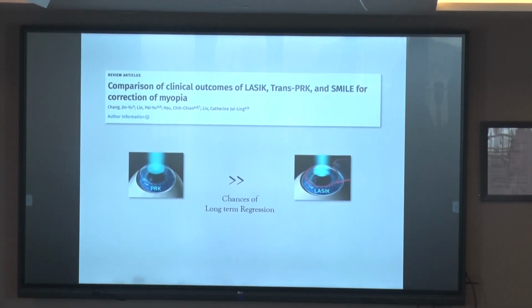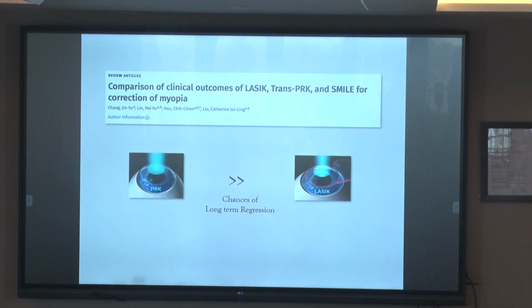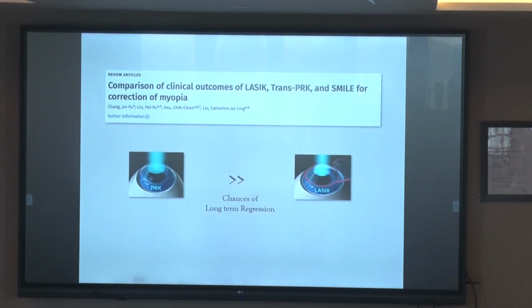The first and foremost is the risk of retinal detachment with a family history. Well, all our patients, whether they are low myopes or high myopes, we need to do a thorough examination of the retina, a thorough indentation examination in case there are suspicious areas which need to be treated. They need to be treated, and having done that, the chances of detachment even with a LASIK are probably as low as in any other case.